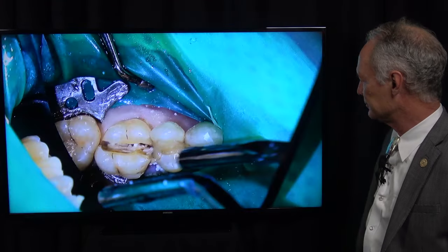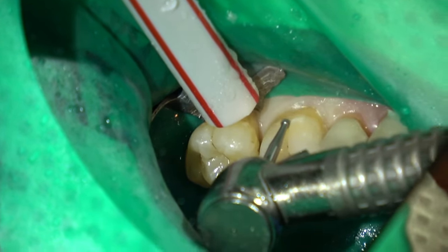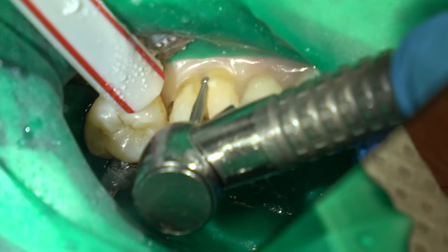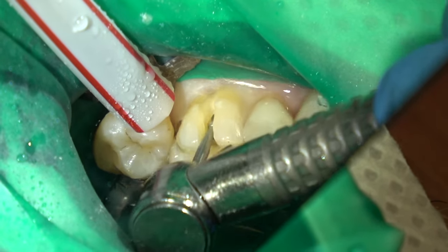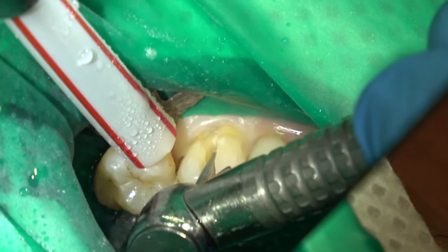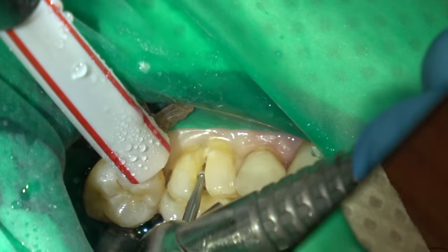So that's the cut from mesial to distal. And now I'm cutting through from facial to the center of the tooth before I get to the palatal root. It's very important that you cut all the way through to the furcation — you don't want that little bit of tooth structure remaining in the apical part of the cut or the pieces won't torque.